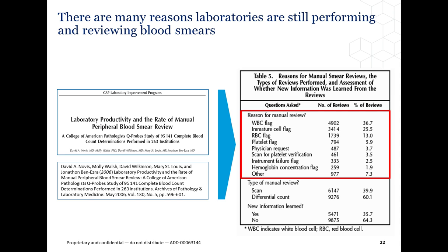As this study is nearly 12 years old, the number of reviews may have improved a little bit with the advent of new technology. But trust me, it's still a very large and considerable number of reviews that remain to this day due to these same reasons. It's interesting also to note that the manual differential represented a 60 to 40% edge over the manual scan. So it appears that people have a tendency, because the improvement of technology has maybe reduced the instance of scanning, but because it cannot resolve the abnormal pathologies, increase the number of manual diffs compared to just trying to do a scan.